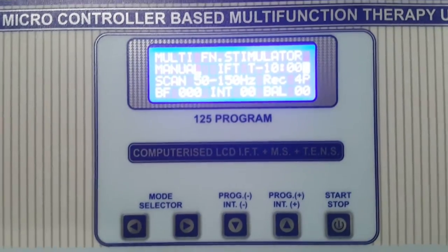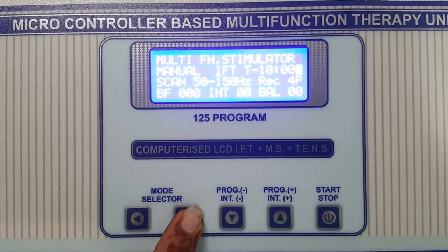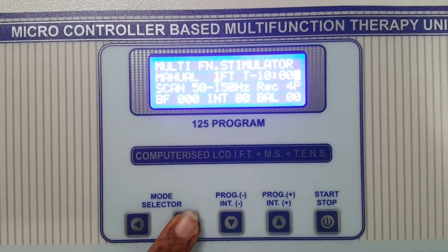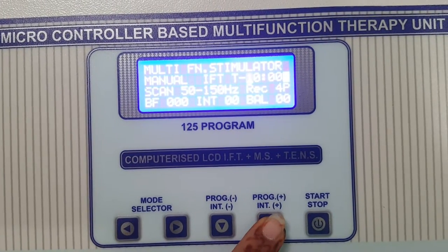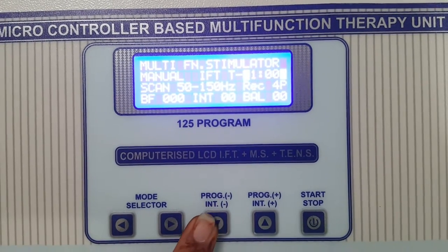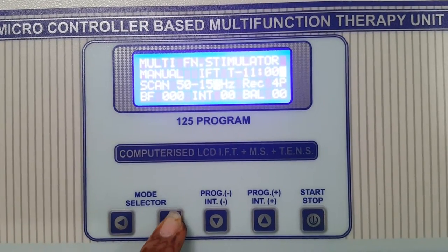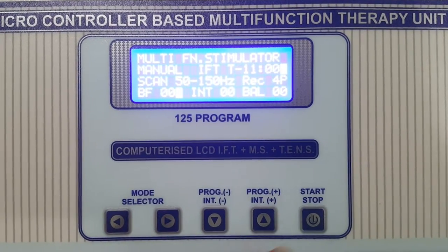The machine will start with the manual mode. You can select the parameters as per your need. These are the selector switches to move the cursor. These are the switches to set the individual parameter settings. After selecting all the parameters as per your need, start the machine.